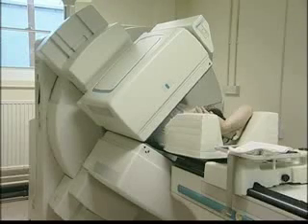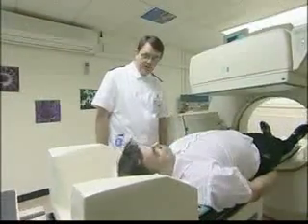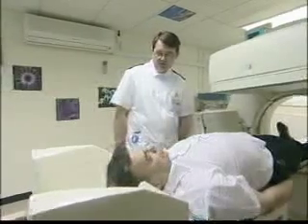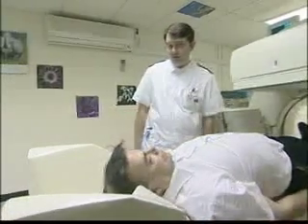That's it, we're all finished now. You can relax. We will be doing some pictures of your heart when it's at rest, and that will be later on. I'll give you all the details about when we're going to do that in about ten minutes or so.